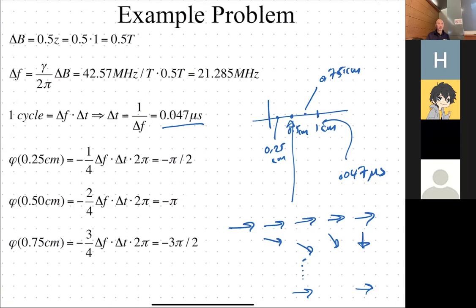All right, question. That change of frequency is the frequency of one spin? Well, it's basically, yeah, we apply a gradient in space. So we don't really think about one spin; all the magnetization at that location will have that frequency. It's basically the average field at that location. In imaging, you look over all the spins in a certain volume or voxel. So it's basically the average delta B in this voxel that determines the rate.